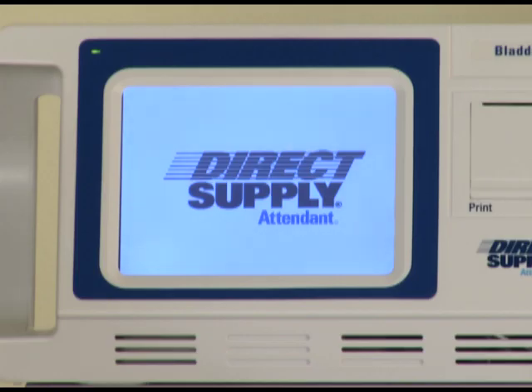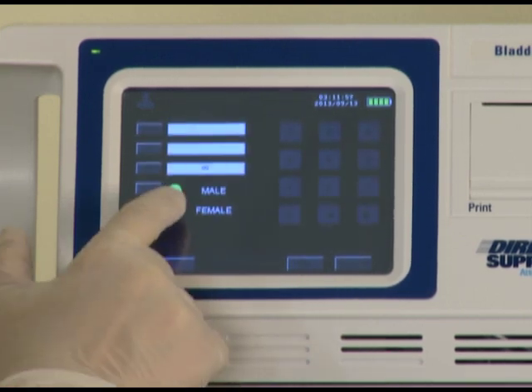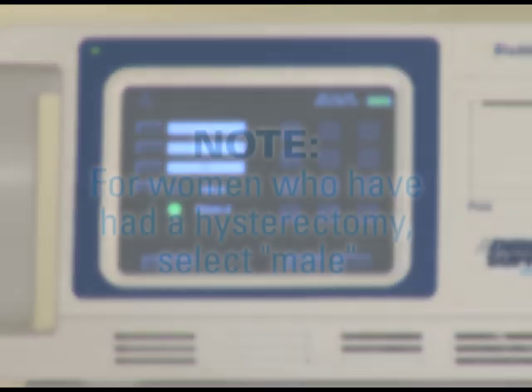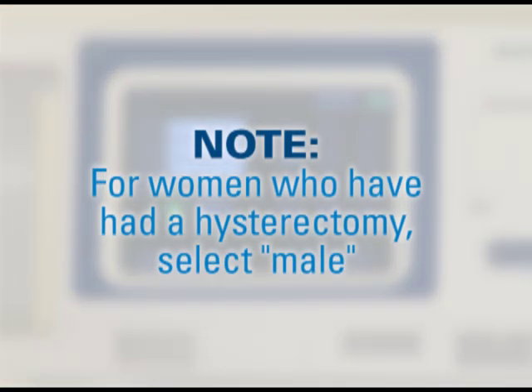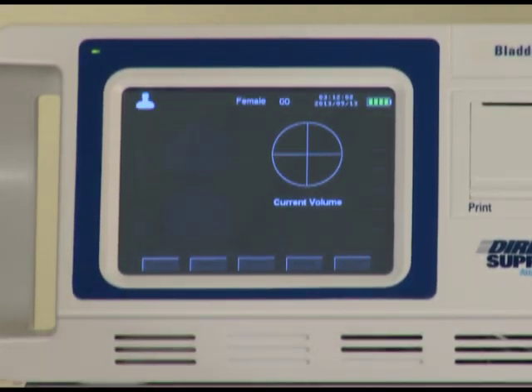After turning on the unit, select patient, and then press male or female. Remember, if a female resident has had a hysterectomy, you'll need to select the male option in order for the bladder scanner to calculate the correct volume. To return to the main menu, press OK.